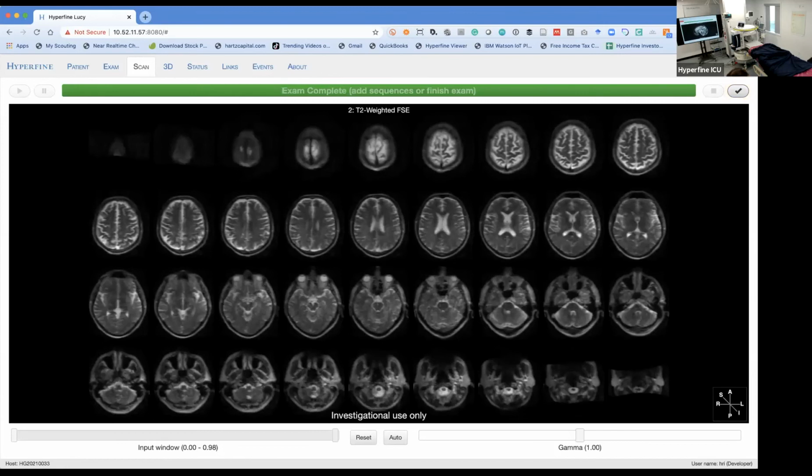We're very excited about the use of contrast agents starting at sites now that we're moving beyond IRB covered research. So agents that are gadolinium based, dynamic contrast enhanced, also ferumoxytol, the superparamagnetic iron oxide agents, we're very interested in those. And we're also working on deep learning based reconstructions to enhance image quality even further and reduce noise of the scanners even further than it is.